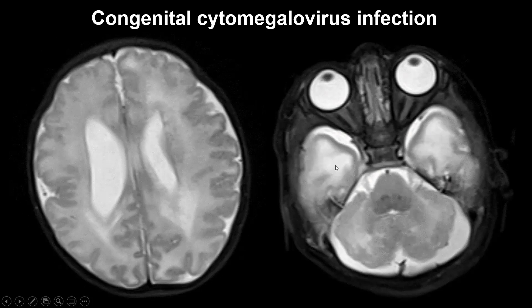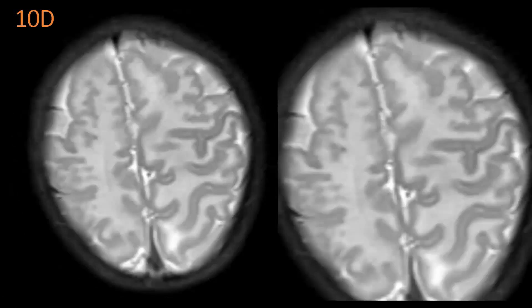Here is an example of a patient with congenital cytomegalovirus infection — a newborn. We see ventriculomegaly, increased signal intensity on T2-weighted images in the periventricular white matter, and especially in the temporal lobes the T2 signal is diffusely increased. There is also some patchy signal increase in the cerebellum. These findings point toward leukoencephalopathy, with the temporal lobe involvement being very typical for CMV. Looking at the cerebral cortex, especially bifrontally, we see that the cortex consists of many very small gyri — we are dealing with polymicrogyri caused by congenital cytomegalovirus infection.